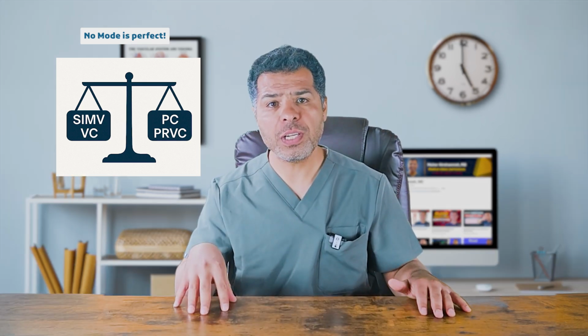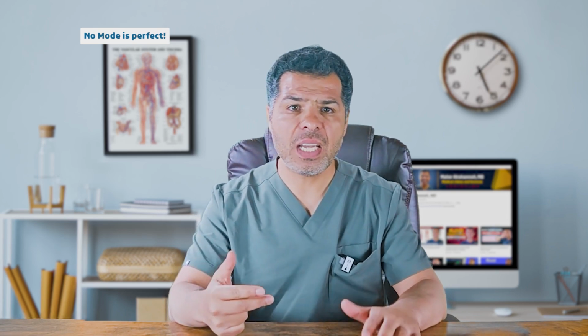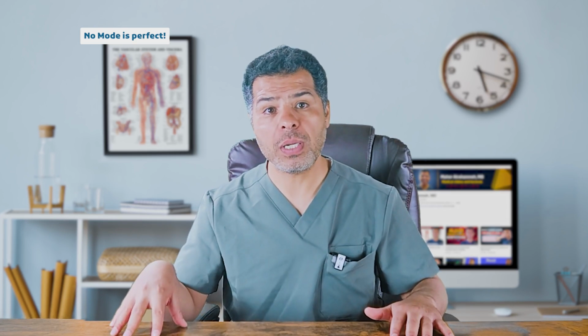The choice of ventilation mode should always be individualized based on the patient's clinical status, lung mechanics, and response to therapy. I personally like PRVC as it may offer advantages in terms of lower peak inspiratory pressure and more stable gas exchange, making it a reasonable first choice among the three modes.